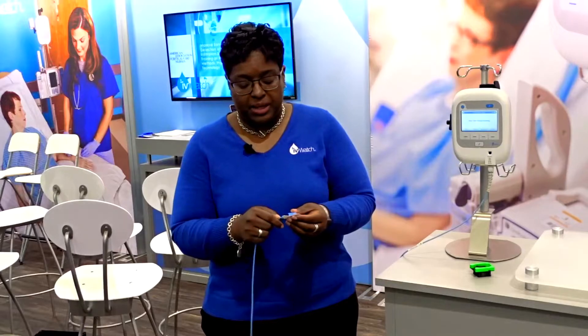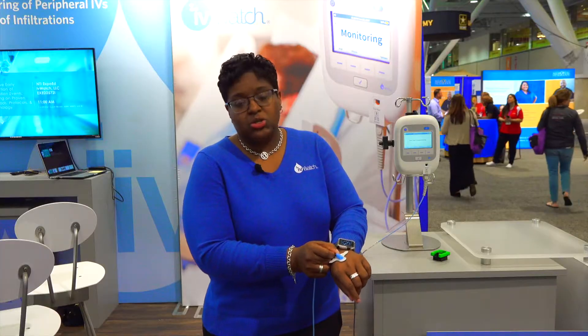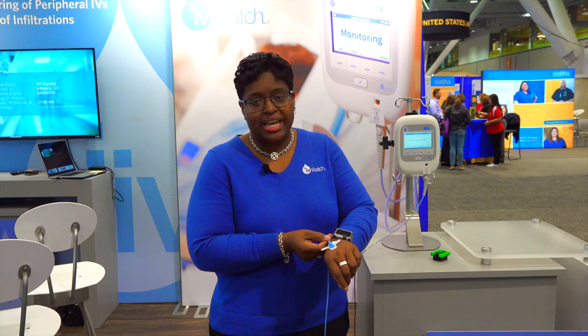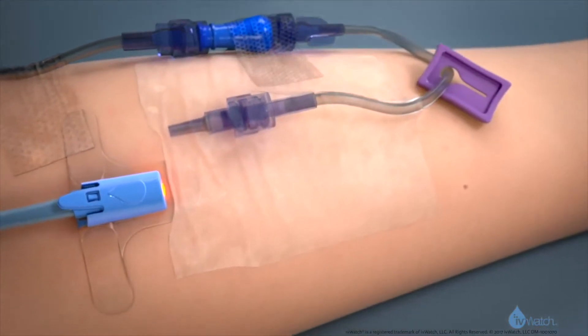Let's do a quick demo. For setup, you want to place the sensor cable into the receptacle — that's what goes onto the patient's skin. With the catheter placed, you want this to sit just adjacent to it, about an inch away from the insertion site, which puts you right around the tip of the catheter. This is adhesive-backed; it goes on the skin, and we recommend anchoring the wings with a little Tegaderm.